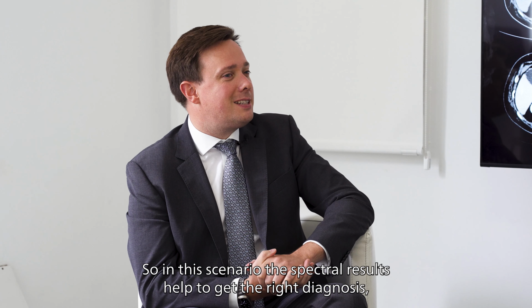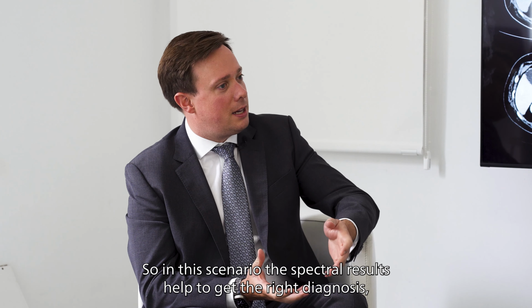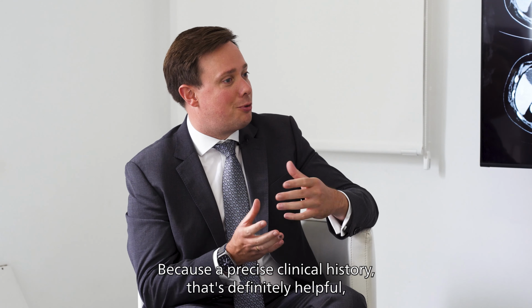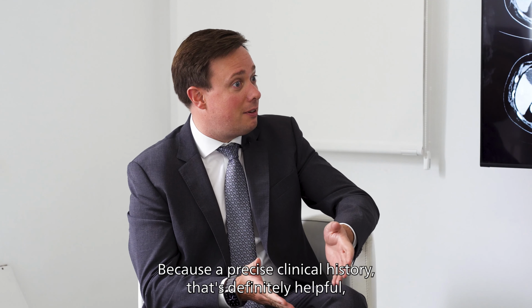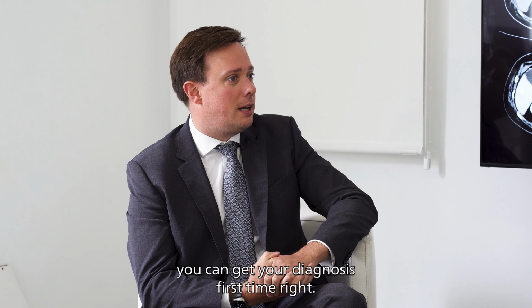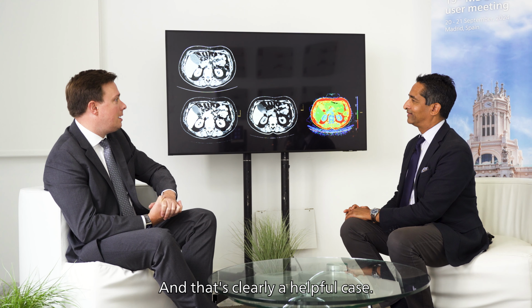So in this scenario, the spectral results help to get the right diagnosis without doing any additional exam, right? Just because with a precise clinical history, that's definitely helpful. But then with the power of these multiparametric images, you can get your diagnosis first time right. And so that's clearly a helpful case.